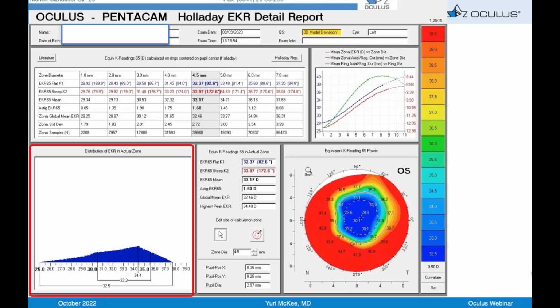It's a low flat curve. Which one's right? Which one's going to give me the correct lens power to make this patient glasses free, because that's what they're paying for with a specialized EDOF or multifocal IOL. And you just simply don't have the mathematical certainty to get the right lens power. So irrespective of any high order aberrations, the basics of getting the right lens power is very difficult. It's about 65% in the best of hands, i.e. Warren Hill, at choosing the best lens power.